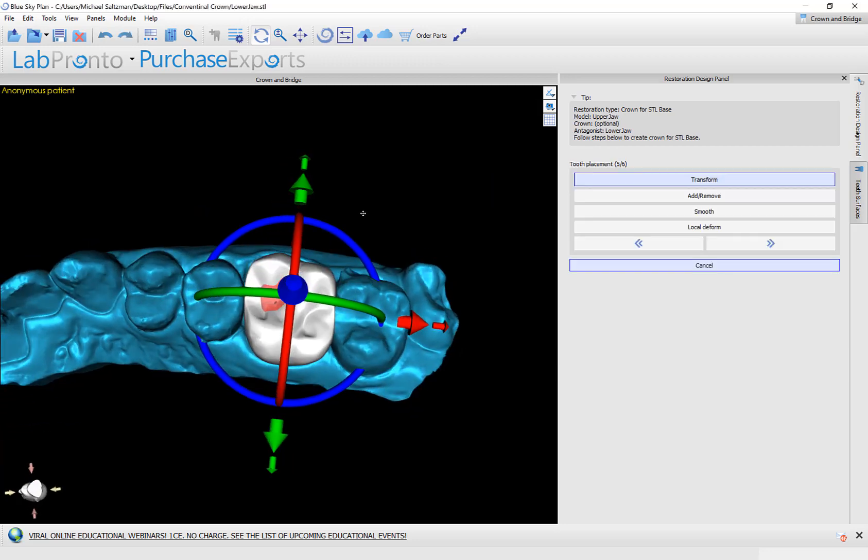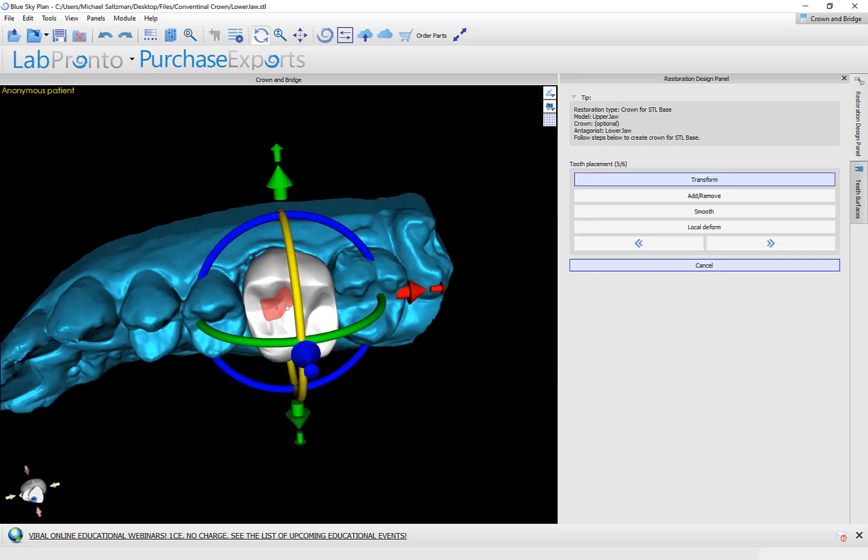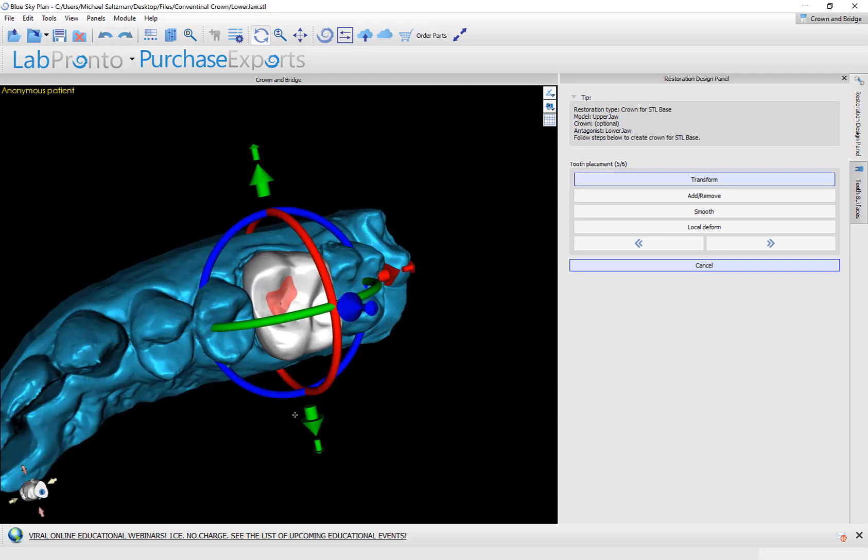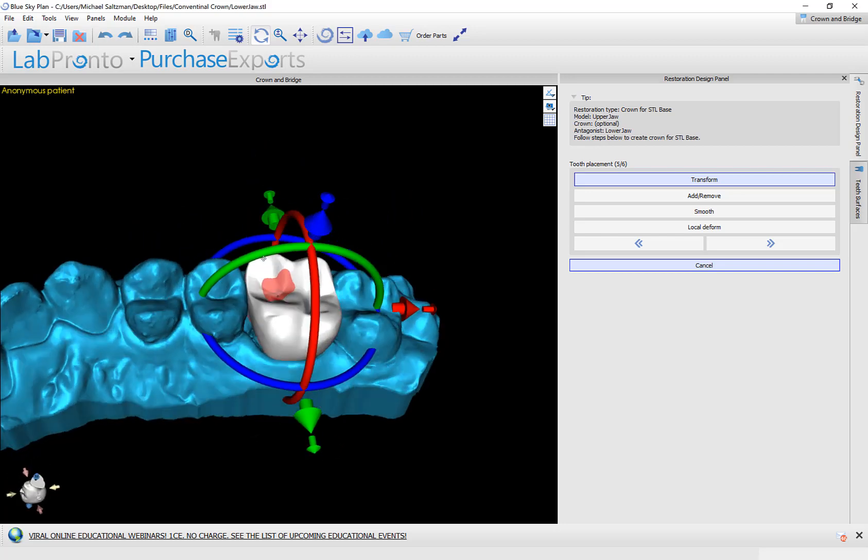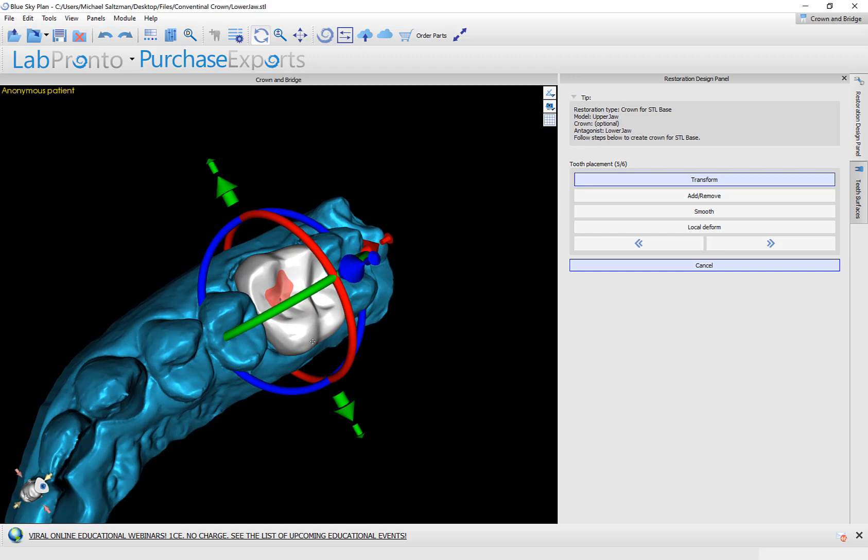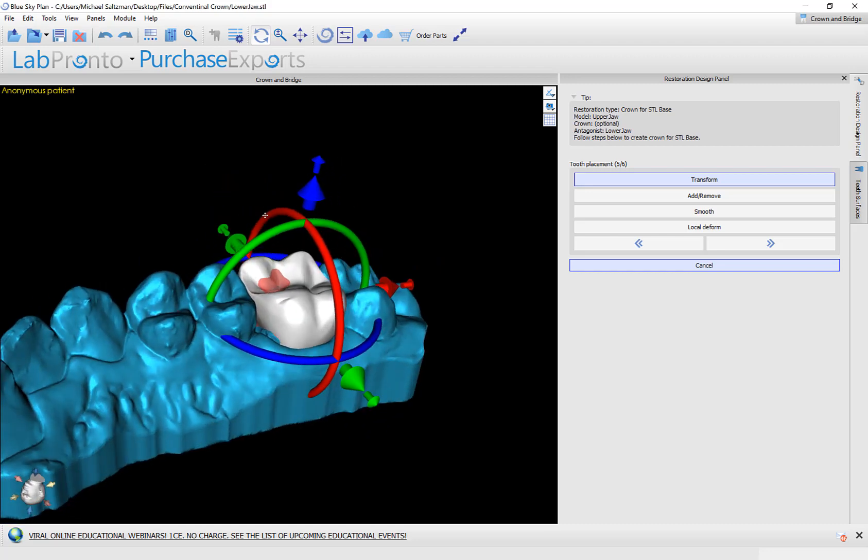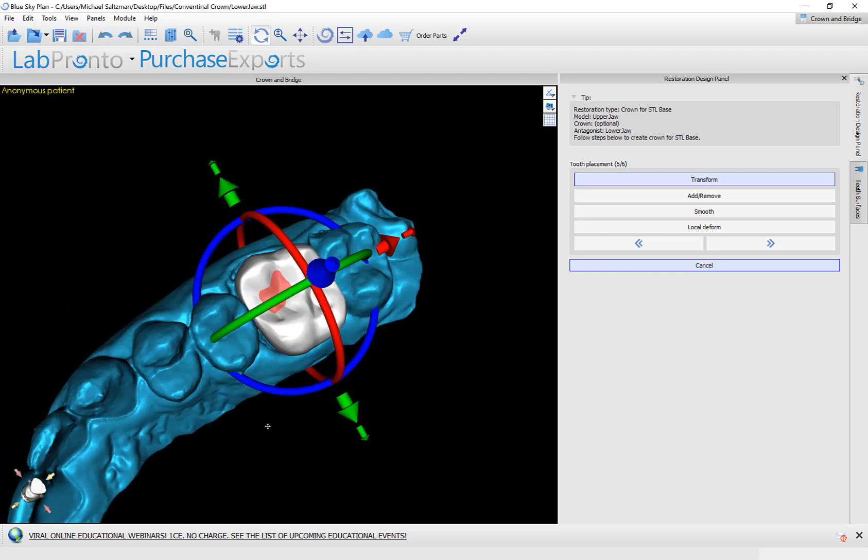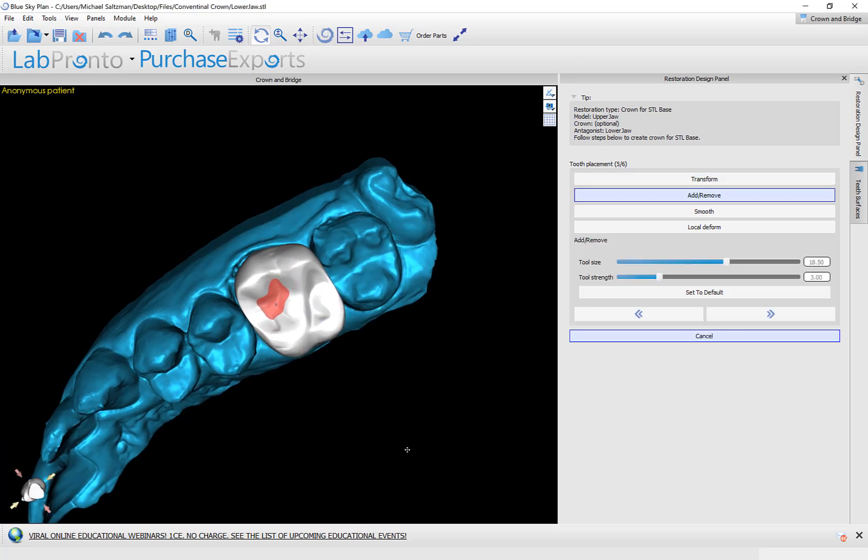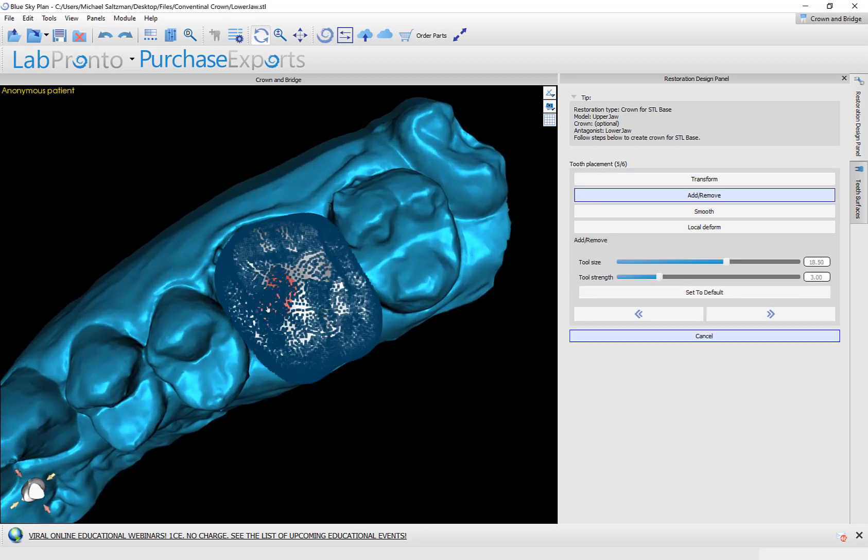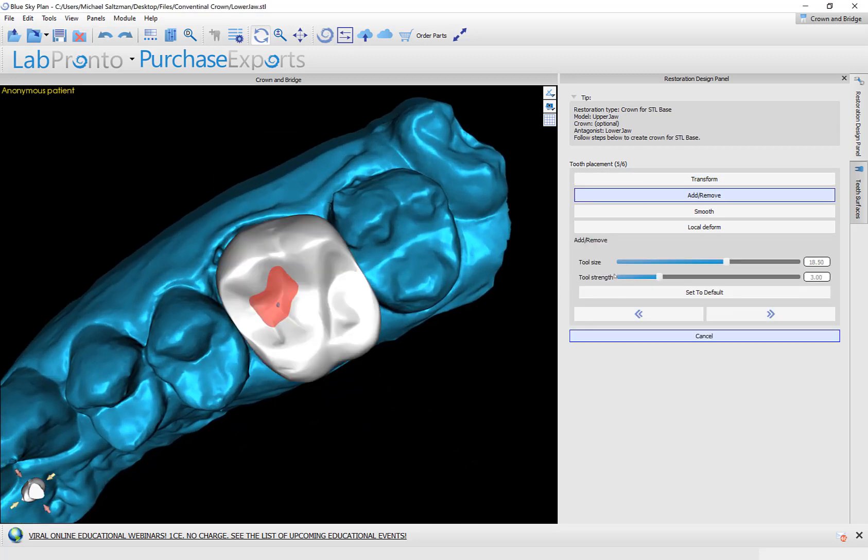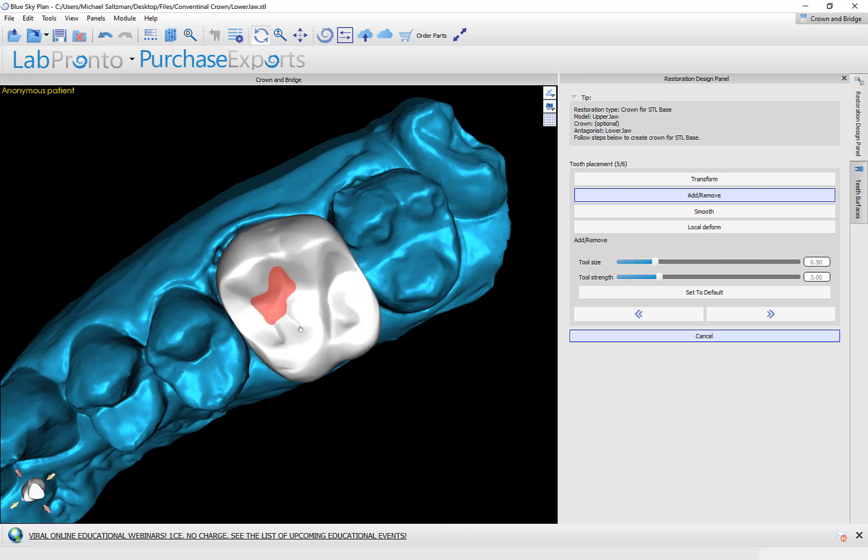The software has placed the tooth automatically. We can see the red indication indicating that our minimal thickness has been violated. And we can go ahead and use different editing tools to modify or edit the shape of the tooth. So we have add remove, which does simply that. You can hold down the shift key and use your left mouse button to add material. Control and left mouse button to remove material.